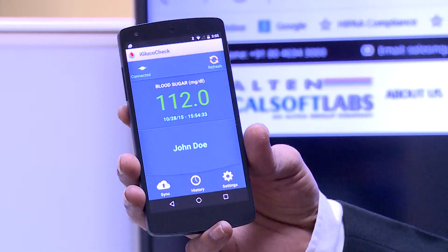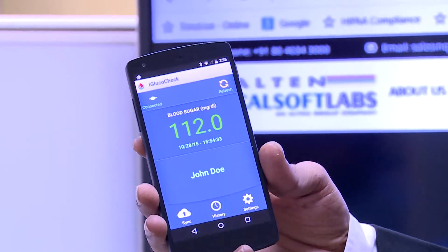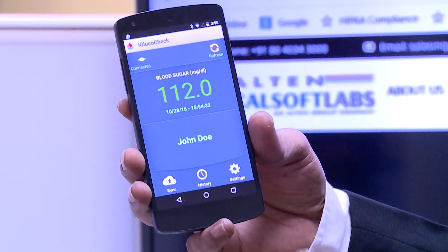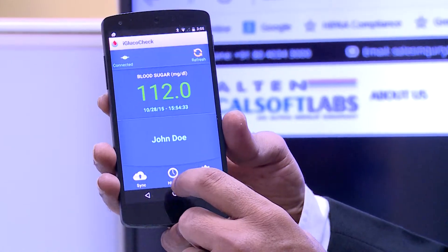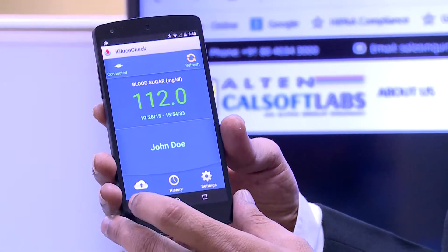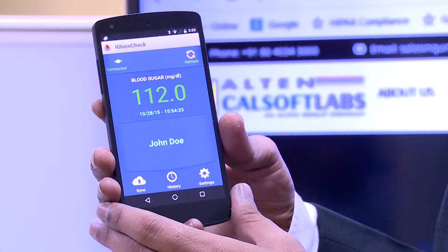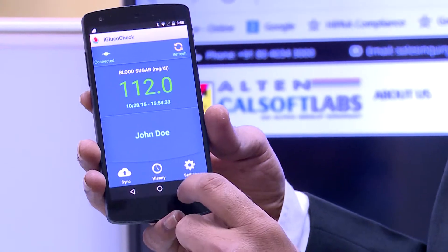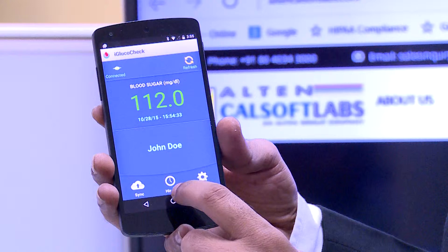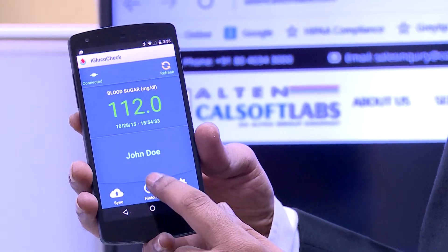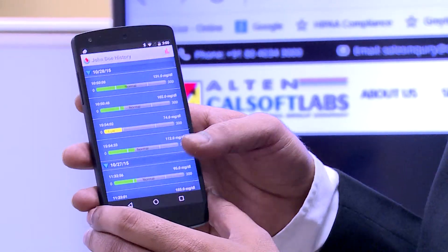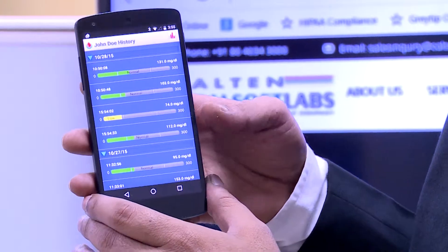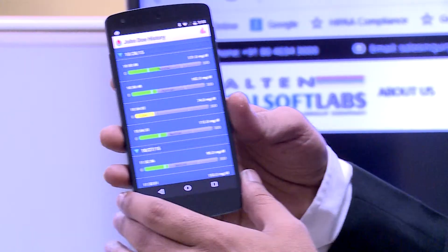For the patient or the user, the device also collects the historical data read from the glucometer device. So if a person wants to view the historical data, they could go and read the data.